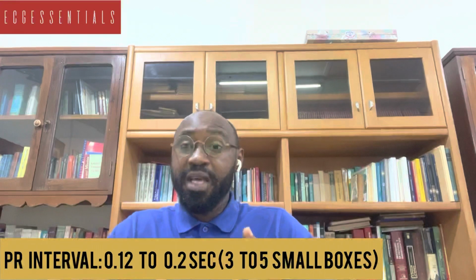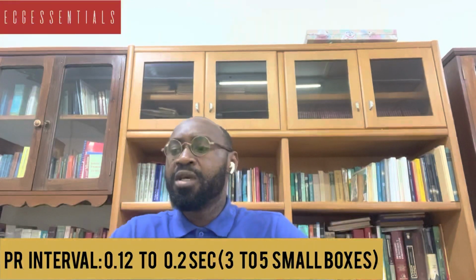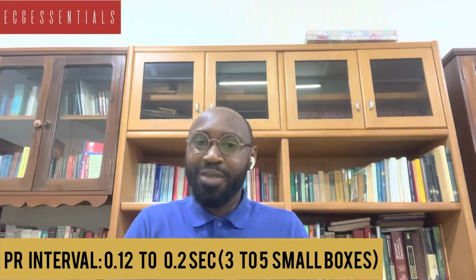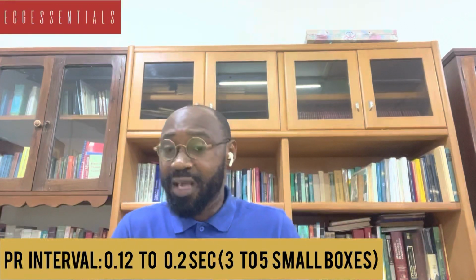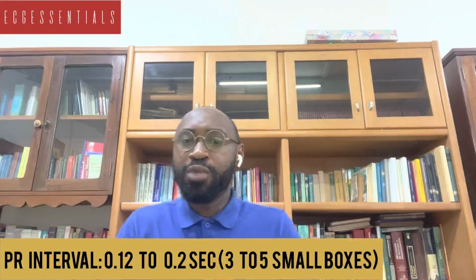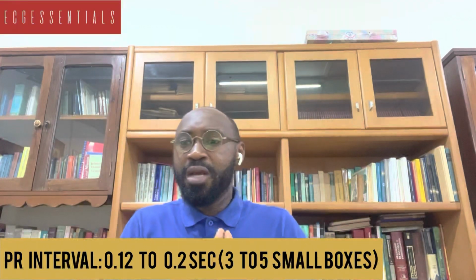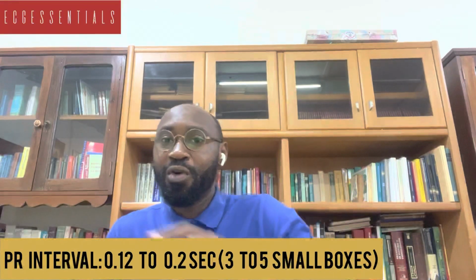Of course, that delay is actually the PR segment, and usually the PR interval is accepted to be between 0.12 seconds and 0.2 seconds. So that will be between 3 small boxes and 5 small boxes.